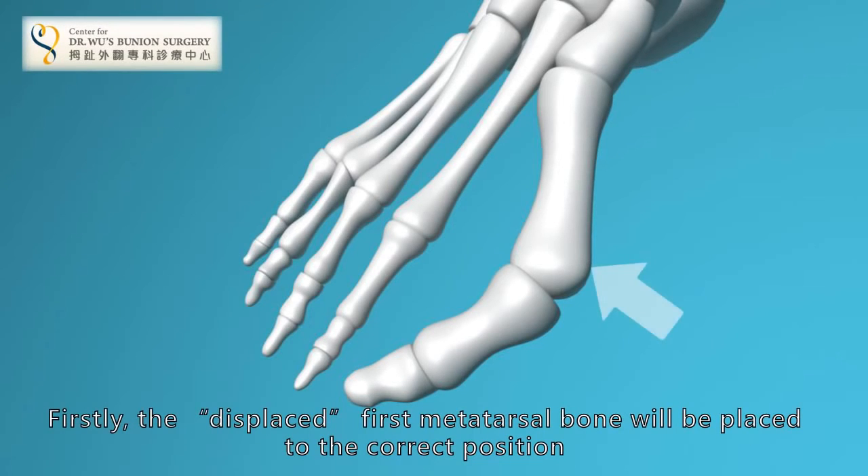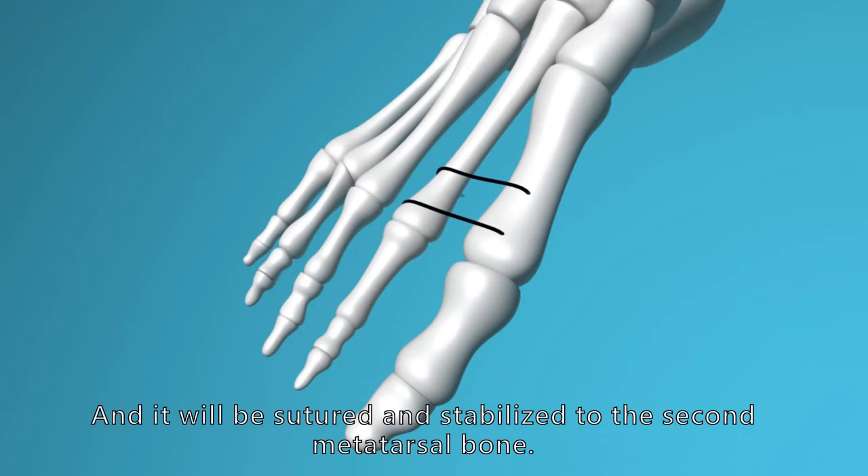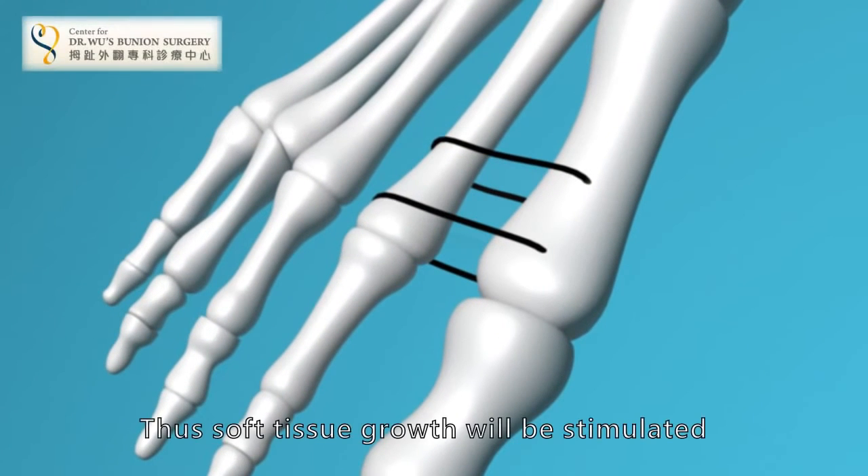Firstly, the displaced first metatarsal bone will be placed to the correct position and it will be sutured and stabilized to the second metatarsal bone. Thus, soft tissue growth will be stimulated.